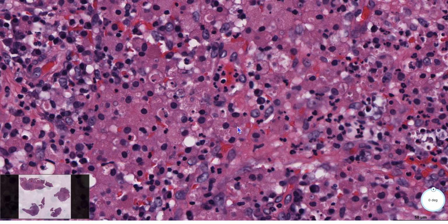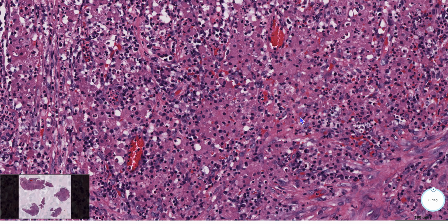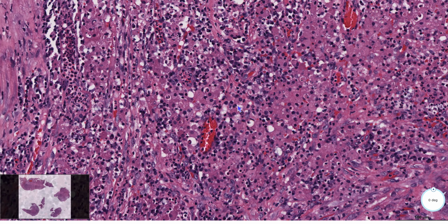calcium or iron deposits. So if you do a von Kossa stain, it will light up. It could be in the histiocytes, and it could also be in the background. And the way I look for the Michaelis-Gutmann bodies is they're smaller than all the other nuclei, and they shouldn't have a nucleolus. So treatments are antibiotics that target those histiocytes that contain the undigested bacterium.